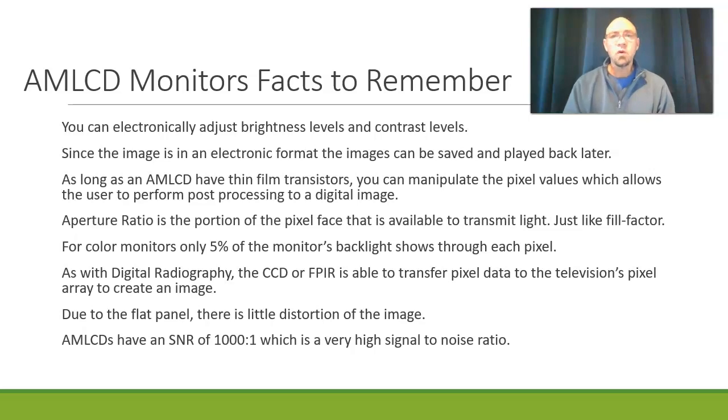So we've talked about AMLCDs before, and I don't want to spend too much time going over old material, but just as a refresher, these are active monitors, and so we can make all of these different adjustments, whether it be the brightness levels or contrast levels or different shades of gray, just by using buttons right on the monitor itself. So that makes it very easy for us to adjust the image, which is great.